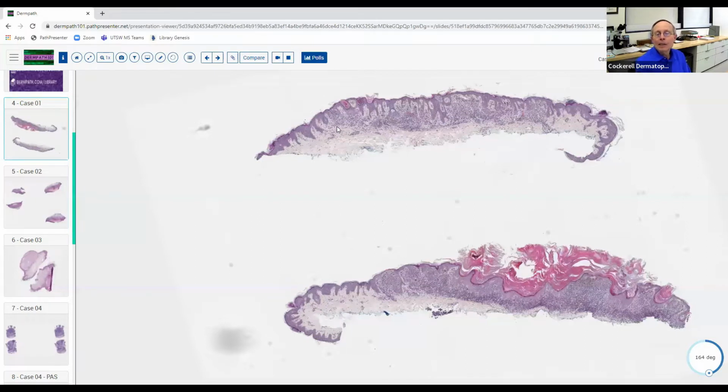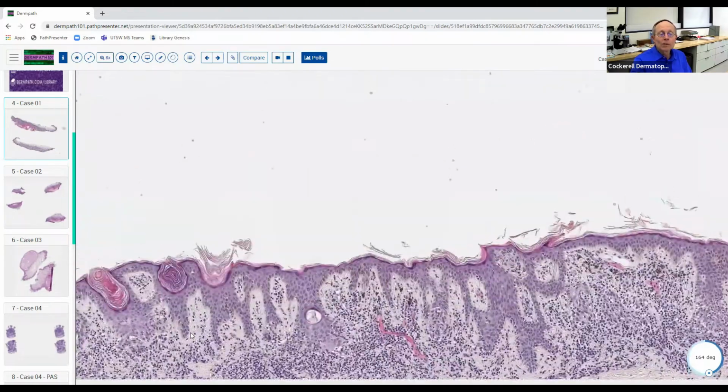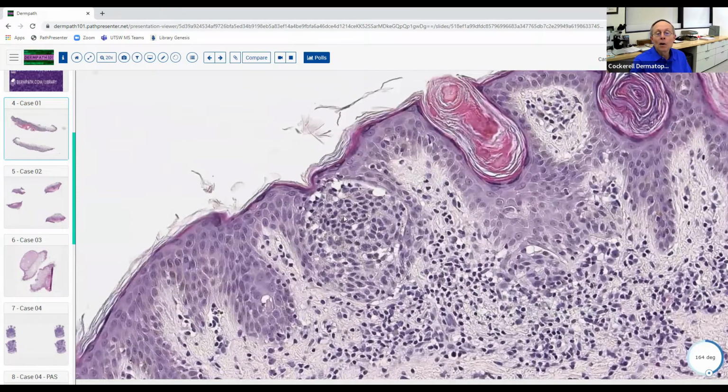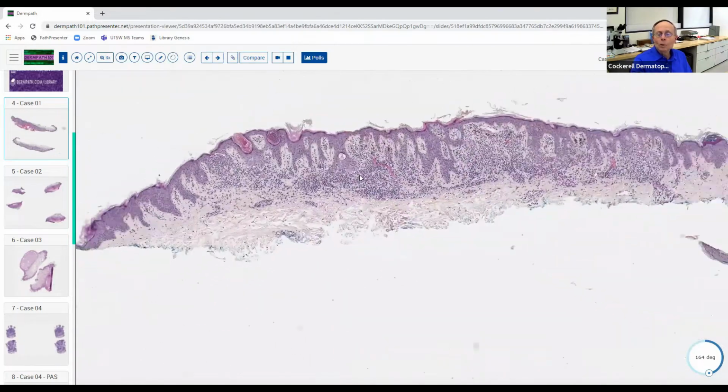And again, I think that's because it's just targeting where the nevus cells are located. And then you don't want to overcall it melanoma, obviously. So you want to look and see if you can identify the morphology of the nests. You can see they're pretty small and not very atypical, with no mitotic figures or anything like that. So this is what you see in a halo nevus.